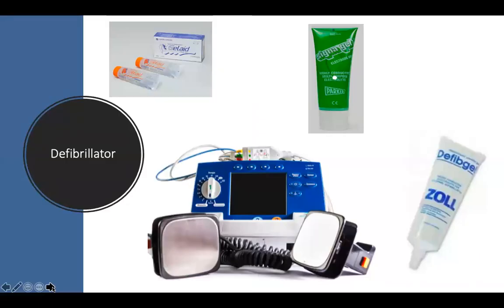Defibrillator, extremely important. So some hospitals don't actually have the proper electrode gel. So the gel that you need for a defibrillator must be conductive gel, not ultrasound gel. Otherwise, you will burn the patient. So these are the types that are currently, I think, on tender. They are in our hospitals. I have seen, we used to have Gel Aid in our institution. I am not seeing it anymore, but I've seen Signa gel, and I've also seen this one as well.